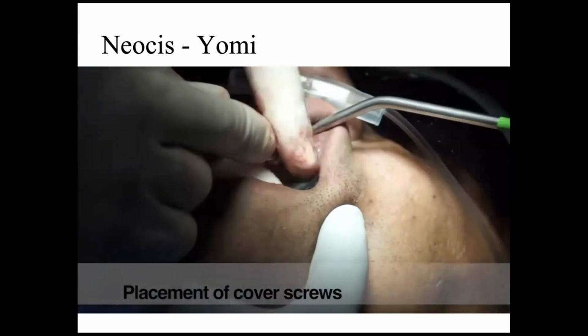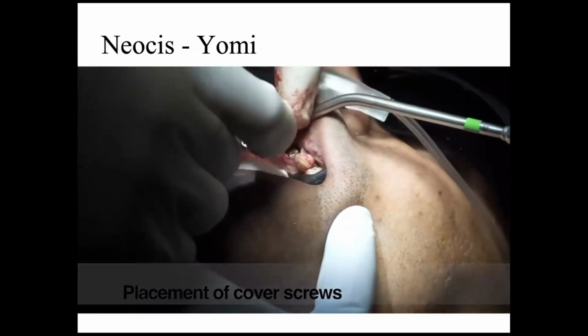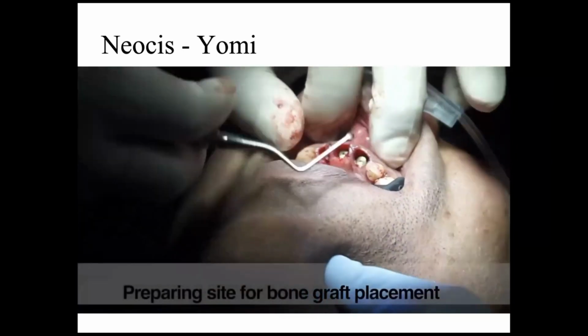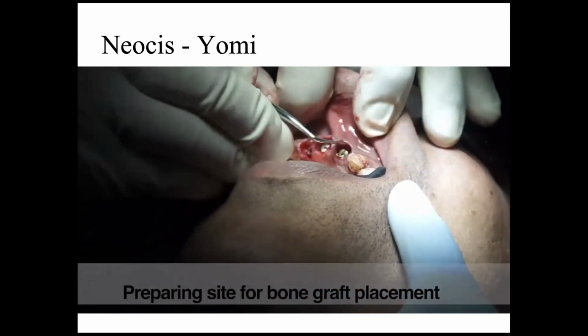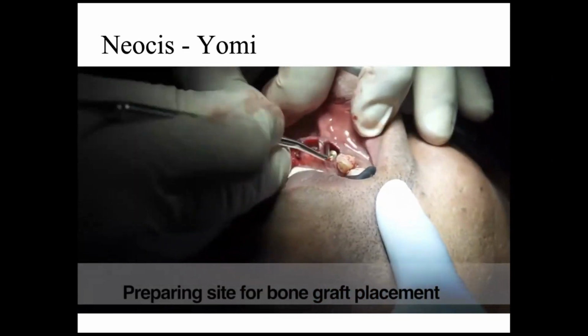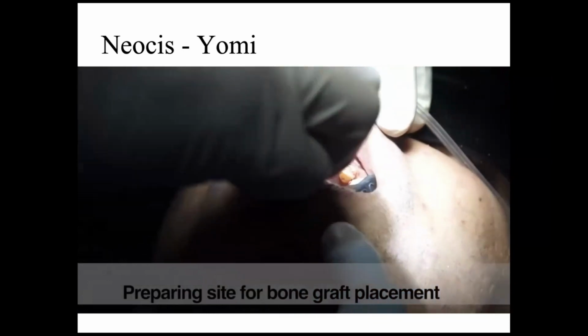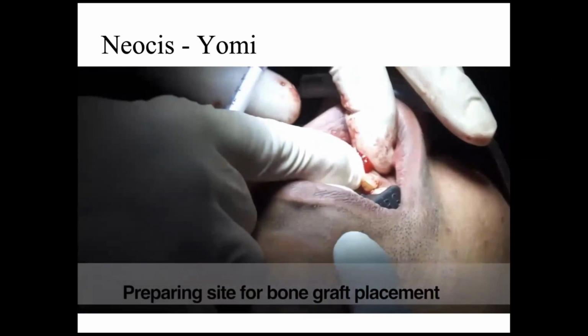The other thing I like to do, especially in maxillary anterior cases, is to bone graft the buccal plates and the buccal shelf. So I'm doing a subperiosteal dissection. Again, a lot of these cases are flapless. I try to make sulcular incisions. We're not doing a lot of releasing. And I always put a cover screw, because obviously we don't want to get the grafting material in the implant itself.